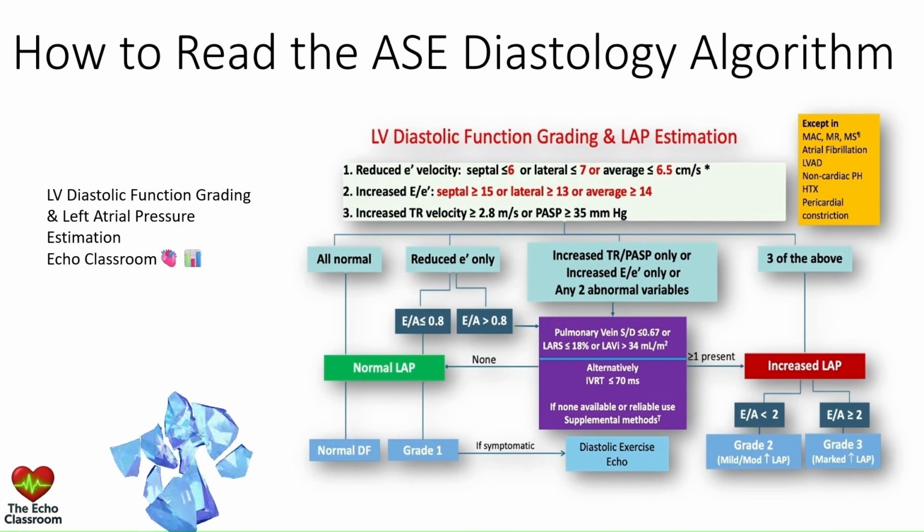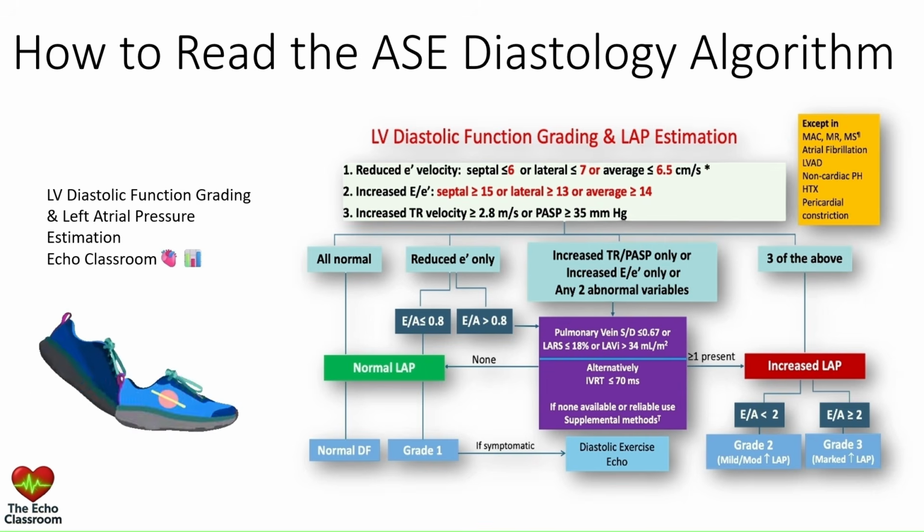Today we're going to break down the ASE Diastology chart and learn how to read it so it actually makes sense. Many people look at this ASE chart and feel overwhelmed, but it actually follows a very logical flow. Today, we're simply going to learn how to read the chart step by step.